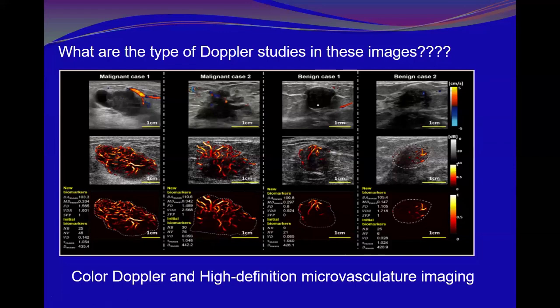So this is also, but the vascularity here is a little bit less than this one. And that was invasive ductal carcinoma. Even if you look here, you can see vascularity from the anterior. Posteriorly, no vascularity. Even here, there is no vascularity. Might be fibrotic here, this portion necrotic and fibrotic, and this portion still there is cellularity. I don't know, but I'm trying to analyze the findings.